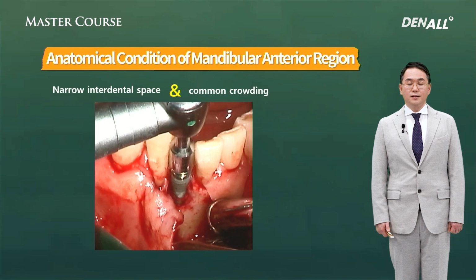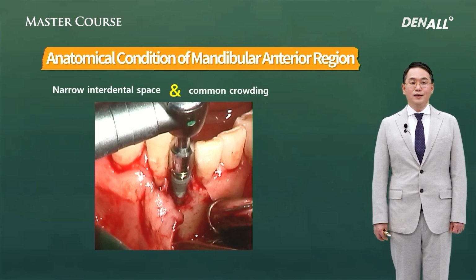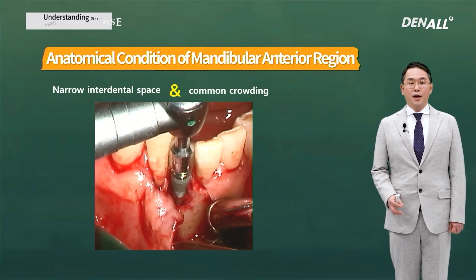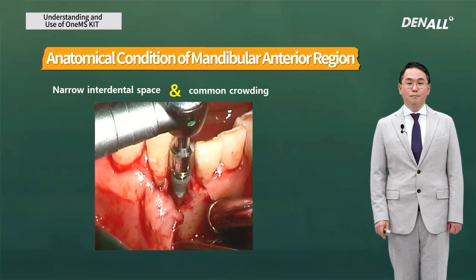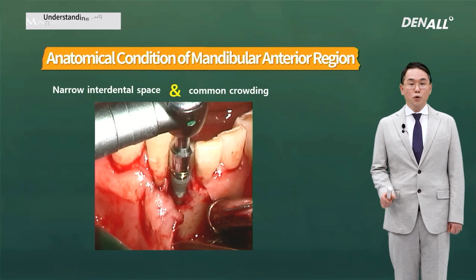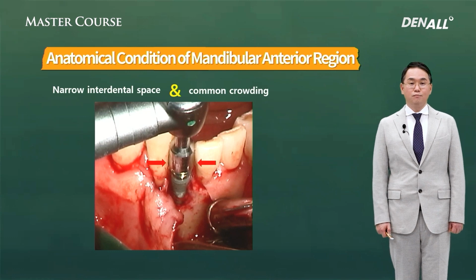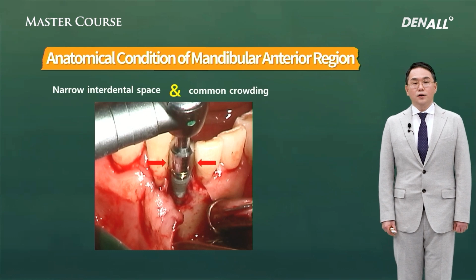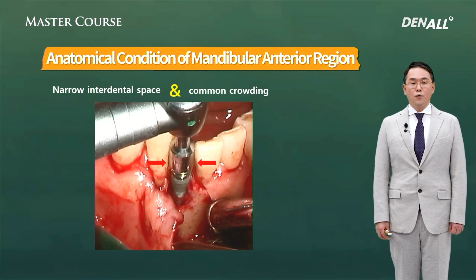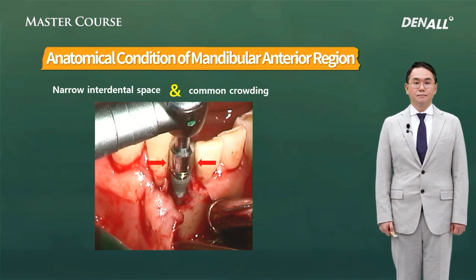One more thing, this can happen when you place a pre-mounted type implant. The outer diameter of the mounted driver, which is used to hold an implant, is about 4.9 millimeters. If the mesial-distal width of the bone is less than 4.9 millimeters, implants cannot be placed in proper positions. Even a 3.5 millimeter diameter implant, if it is a two-piece type, has limitations in placement.